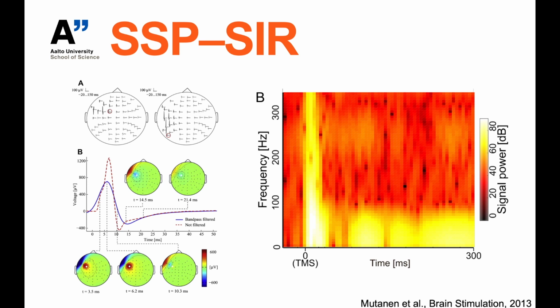On the right side, we can see the time frequency transformation of a typical muscle artifact contaminated EEG time course. The goal here is now to estimate those muscle artifact topographies that you can see on the lower left panel. And we estimate them from the high-pass filtered data because we can see clearly from the right side panel that the neuronal responses are mainly confined below 100 Hz.